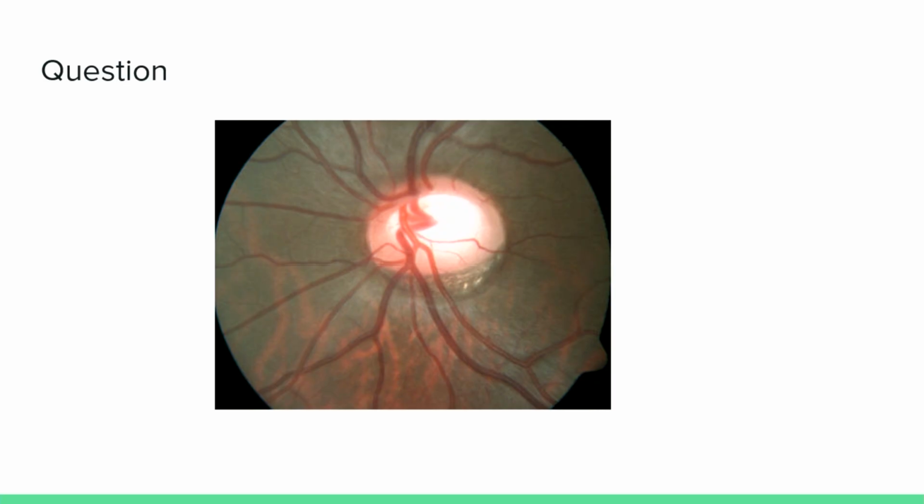If there is a cup and a rim, then the vessel will follow the contour, go down, then come up and bend at the rim and come out. So follow the contour of the vessel, like the upper or the nasal one. You can see it's going up and then sharply bending at the rim. Even part of the inferior temporal, that small vessel. The lower ones are just going sloping, like straight. So there's not much of a bend there. Okay, thank you, ma'am. So the contour is kind of blunted.